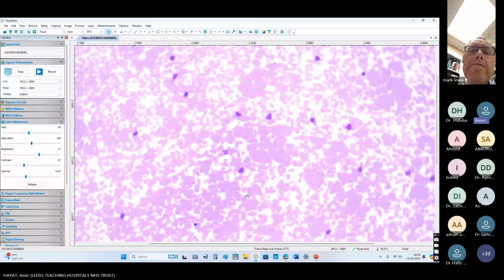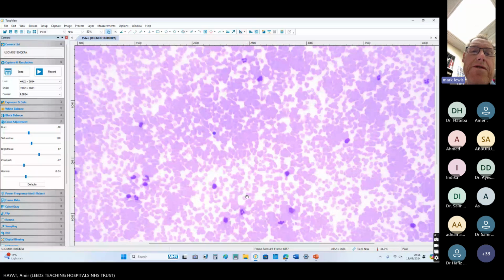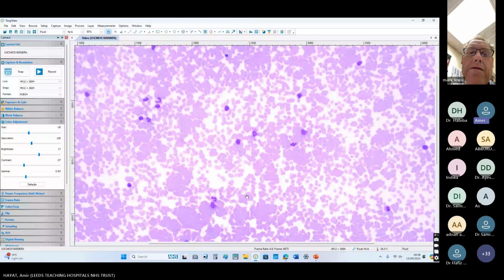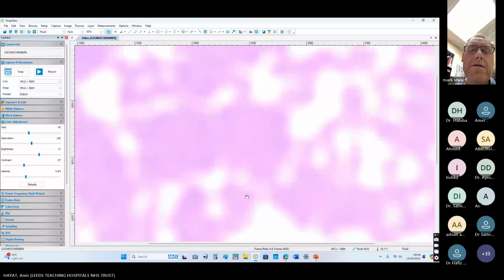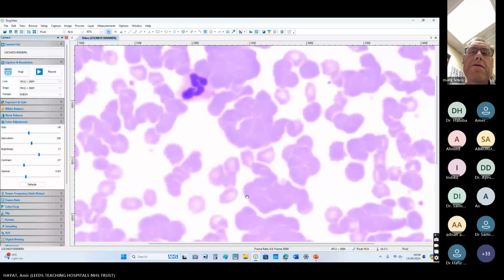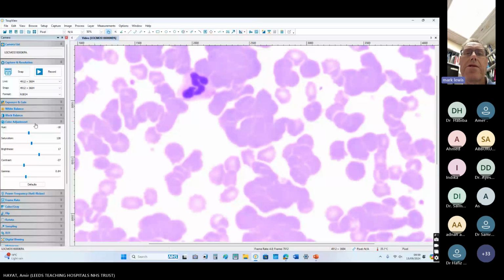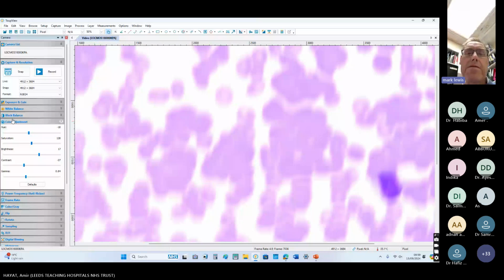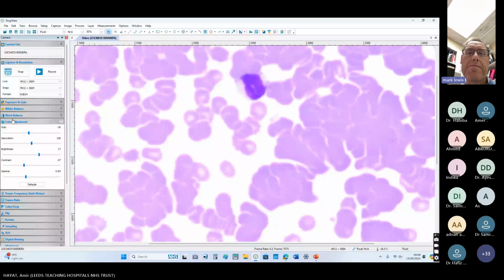Is there anyone from the lab who wants to comment on this blood film and refer to hematology? Yeah, it's definitely cold agglutinins. Thrombocytopenia there, that would account for the bleeding. Looking at the neutrophils. Okay, so this is power 10. I will move to power 50 to make it more clear to you. This is just oil movement, so ignore this movement. Certainly reheat this at 37 in a block and rerun the sample. Definitely thrombocytopenia.